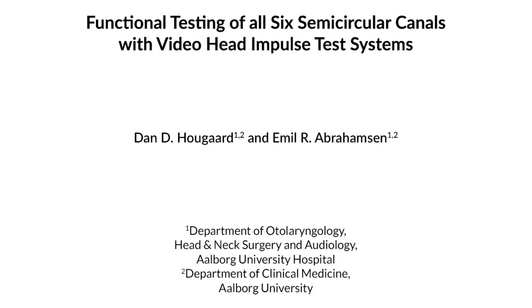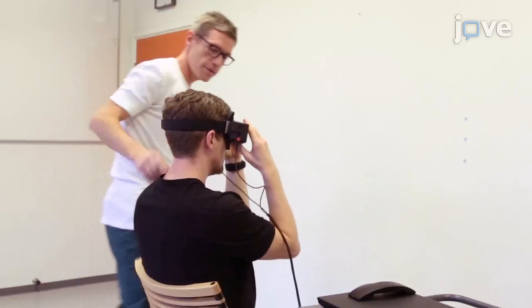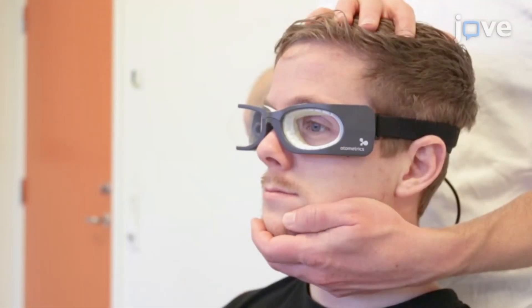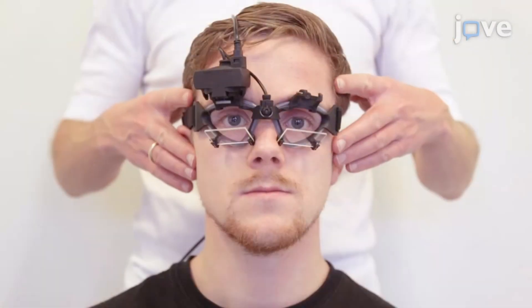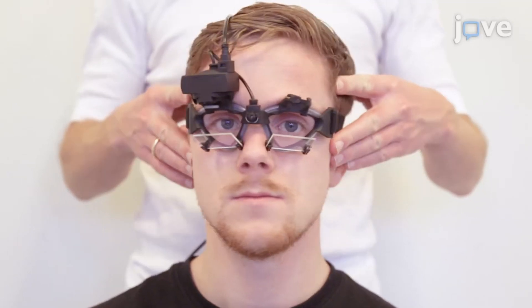This protocol helps clinicians optimize video head impulse testing by visualization of different techniques and by pointing out potential pitfalls and artifacts. The techniques demonstrated in this video enable fellow clinicians to perform video head impulse testing of all six semicircular canals.